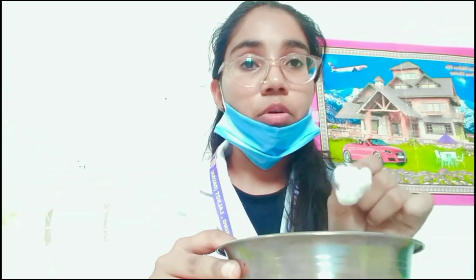So before starting the procedure, we all know we maintain a sterile field. It is very important. Okay. So first of all, cotton balls dipped in antiseptic solution are used to clean the labia majora, labia minora, urethral meatus, and then the urethra. One stroke of a cotton ball is used to clean the urethra and then discard it in the kidney tray.